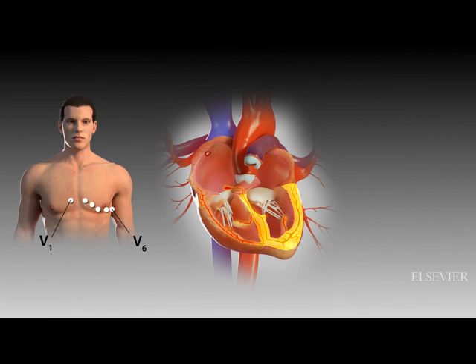This means that after the left ventricle has completely depolarized, the right ventricle continues to depolarize. This delayed right ventricular depolarization produces a third phase of ventricular stimulation. The electrical voltages in the third phase are directed to the right, reflecting the delayed depolarization and slow spread of the depolarization wave outward through the right ventricle. Therefore, a lead placed over the right side of the chest records this phase of ventricular stimulation as a positive wide deflection, called the R prime wave.